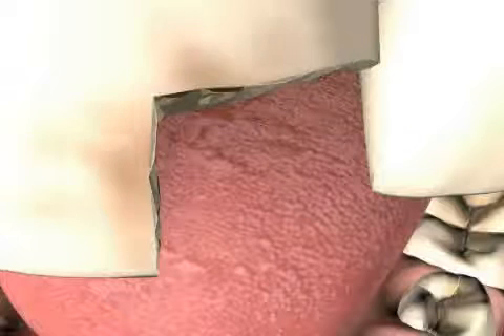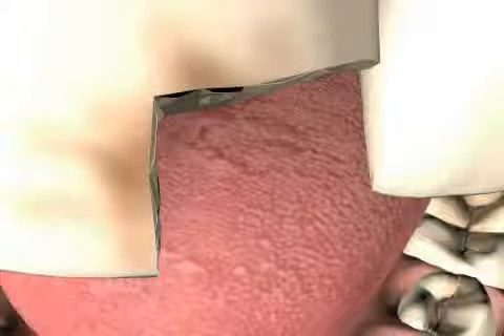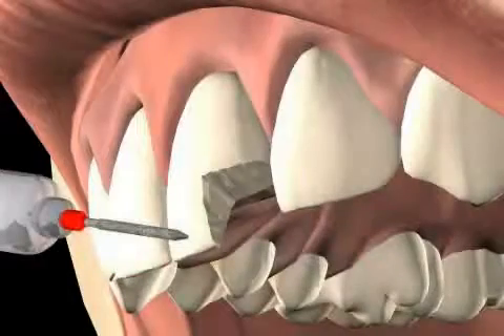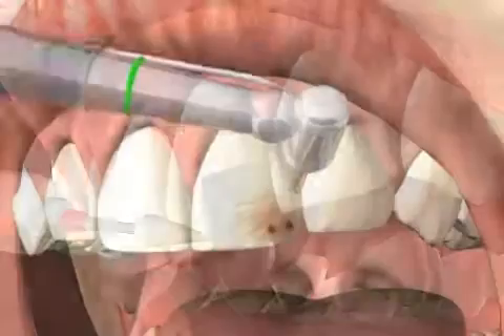However, the diamond also leaves a rougher surface behind, which is much more accessible to plaque bacteria than a smooth surface. Furthermore, rough edges do not seal as well as smooth ones.